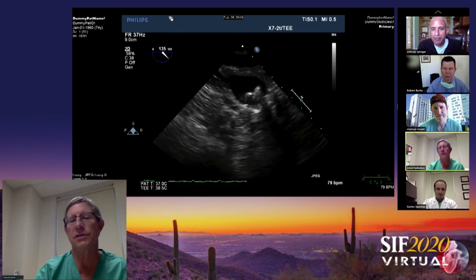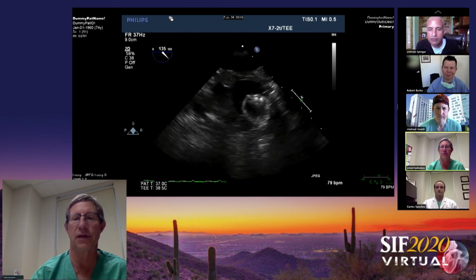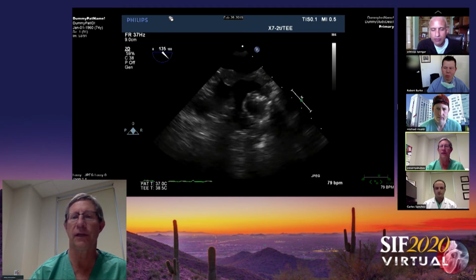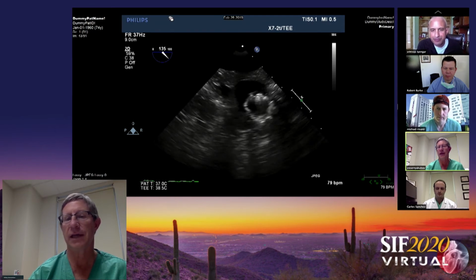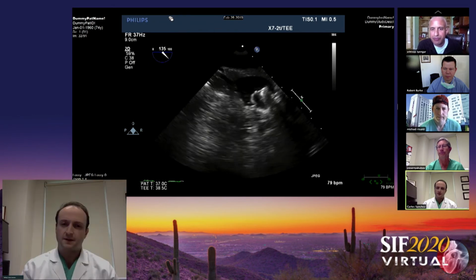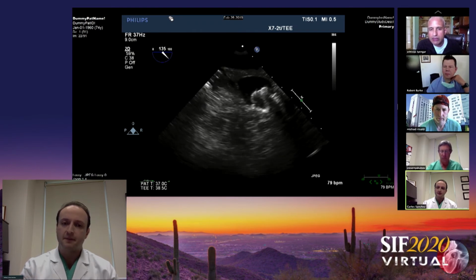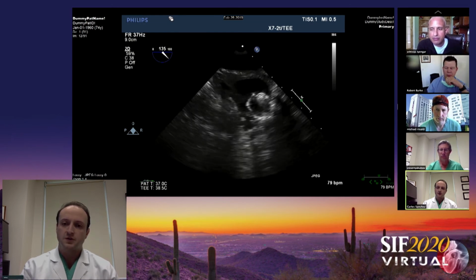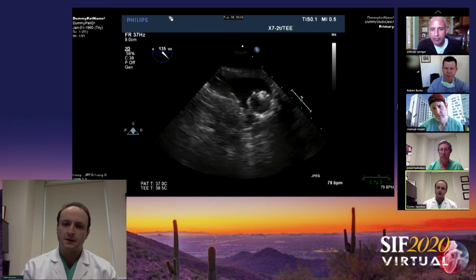You know, one other thing, Herms, is that once in a while, we're usually committed to deploying off of the anterior lobe, but sometimes you have to give it up and try to deploy in an angulation that is more suitable to the left atrial appendage. And I think sometimes that's where CT really helps you. So in this case, if you're committed to the anterior lobe, you're probably not going to get this done. And Srinivas, the other thing is, as you put the next device in and you're trying to buy depth on that anterior lobe, when you're about to deploy, take the anterior torque off. Just let it go a little, and maybe you'll get a more coaxial deployment and not so deep.